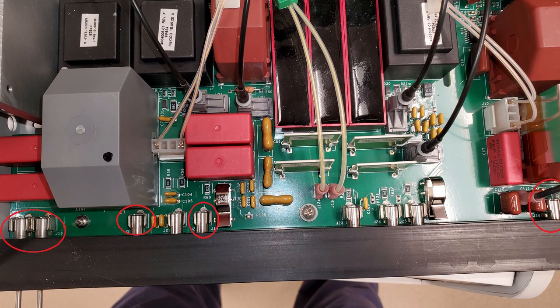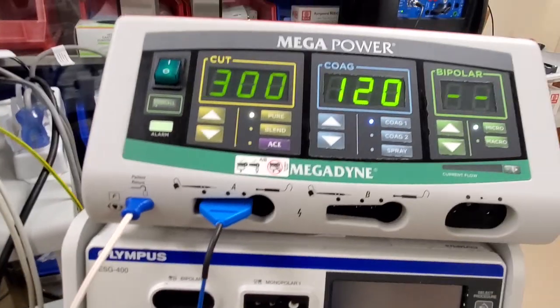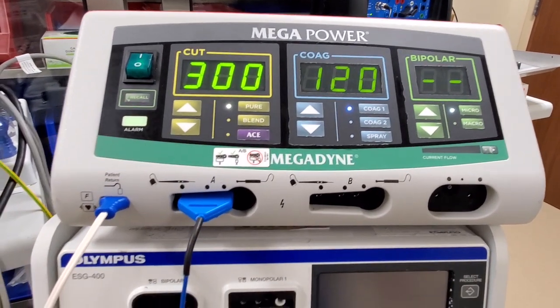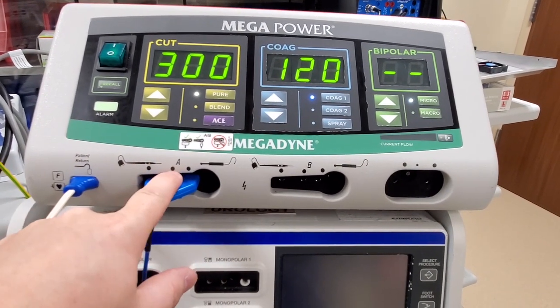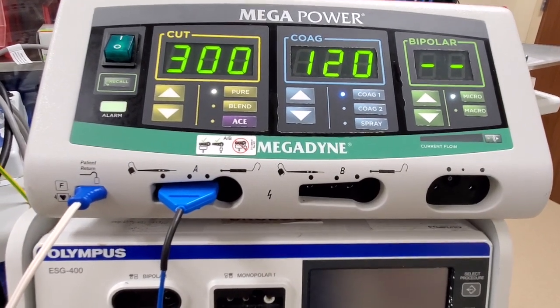I'm going to put up some pictures and show you guys what it looked like before and what it looked like after our adjustment. But now you can see it's working. So all it was, was loose sockets here on the rim, and loose sockets here on the monopolar A, or monopolar 1.